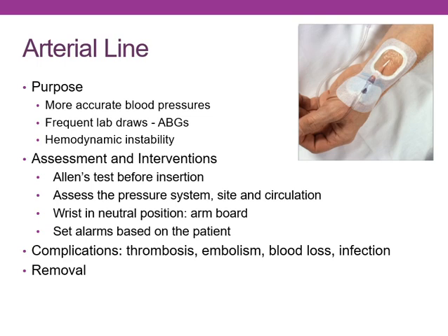So the Allen's test should be done beforehand. I've not ever done it as a nurse. The healthcare providers do it. I do think cath lab staff may do that before they do like a radial heart cath, but an Allen's test should be done. Get your equipment together.